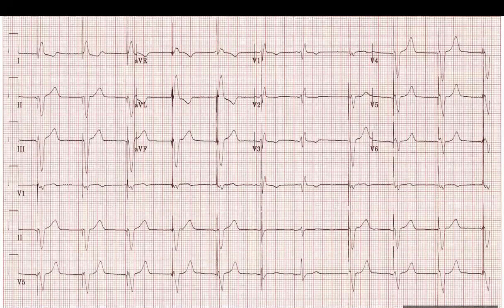There is pacing before each QRS. That's good. And what is the response to the pacer spike? There is a pace spike, right? Yes. And then there is a QRS, so there is pacing and there is capture. What happens towards the middle of the rhythm strip? It becomes no pacing, QRS without pacing.